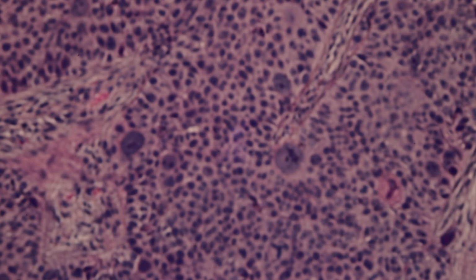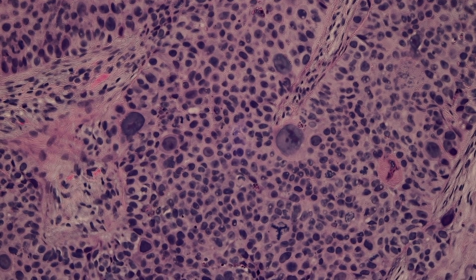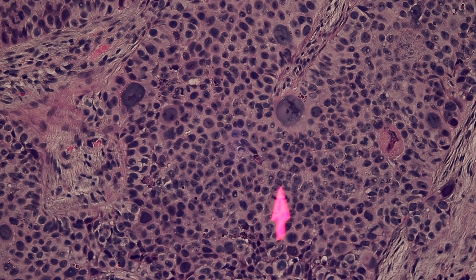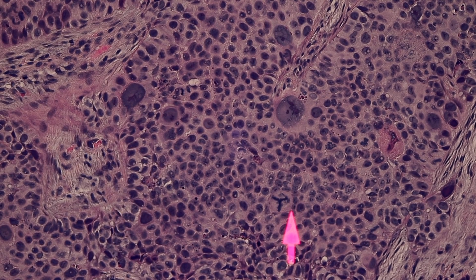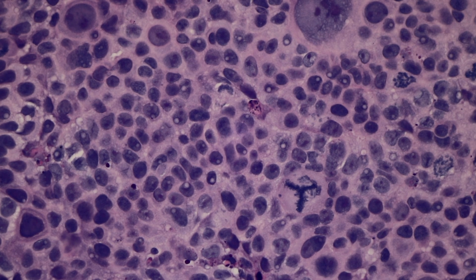Squams, I think, have some of the wildest atypia in human cancers, along with, I guess, high-grade sarcomas, which is interesting because cutaneous squams, even though they look really ugly sometimes, most of them are pretty indolent, except when in certain sites or if they're really large and deep. And then here's a tripolar mitotic figure, and you often have very strange, bizarre mitotic figures in squamous cell carcinomas as well.